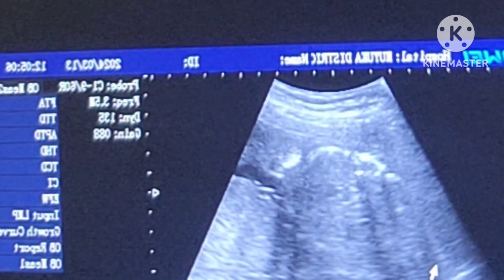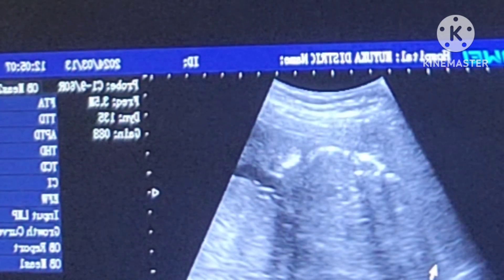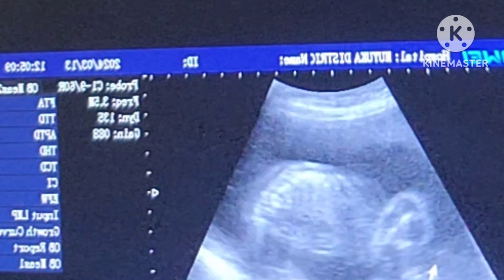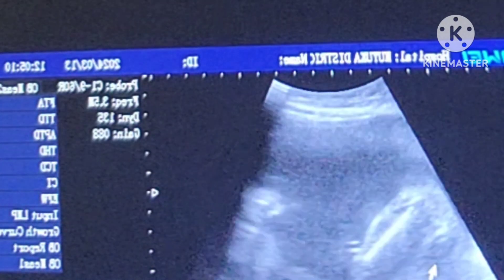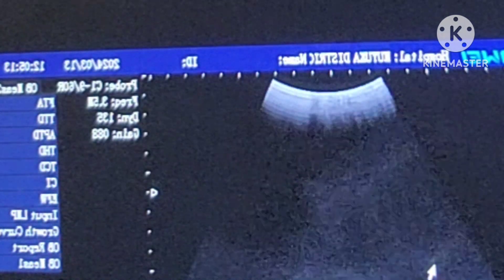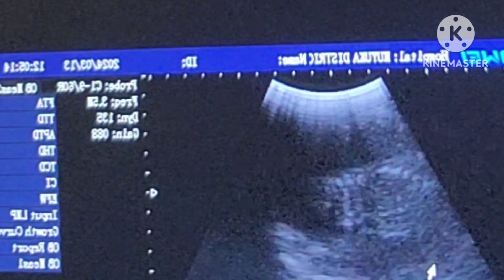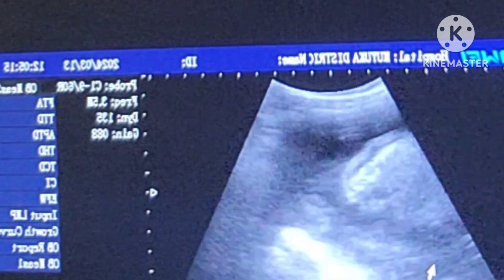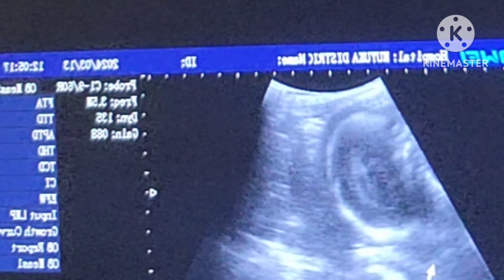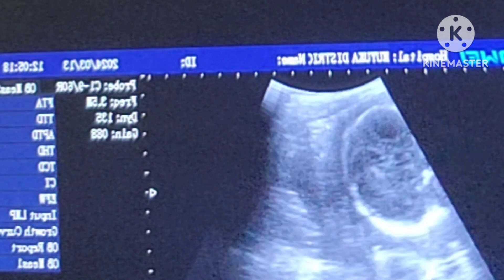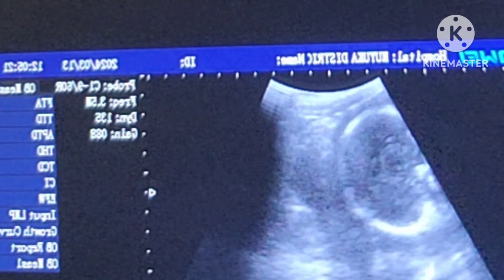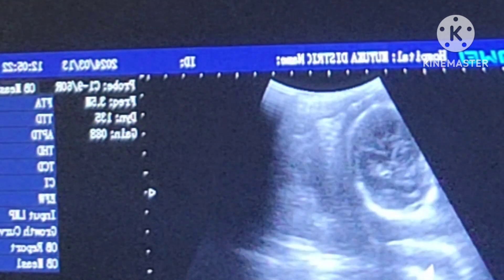Scanning through a fetus is always quite interesting. Amniotic fluid volume and maximum vertical pocket are key measurements. Amniotic fluid accompanies the fetus in the amniotic sac and functions as a cushion for the fetus. One purpose of the scan is to determine the amount of amniotic fluid around the baby.